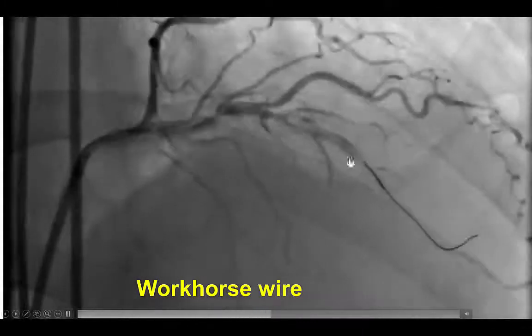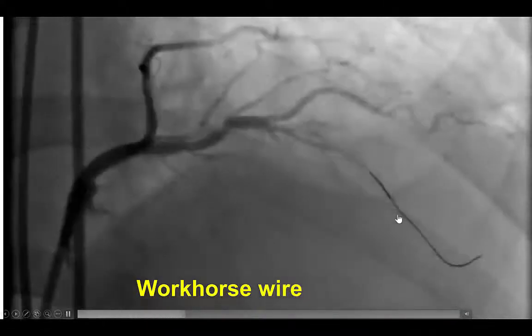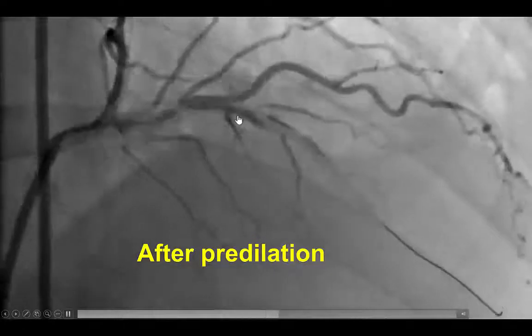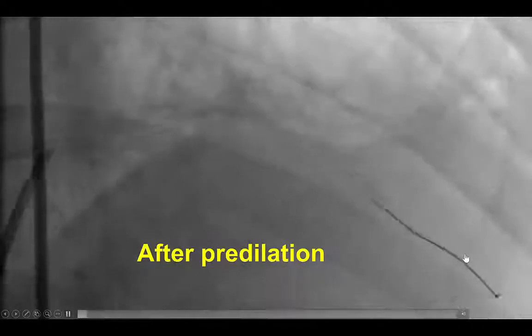We then changed to a workhorse guide wire and were able to advance it into the distal true lumen. The lesion was predilated. There was no further extravasation of contrast. There was clearly an area of dissection, but we did have the wire into the distal true lumen.